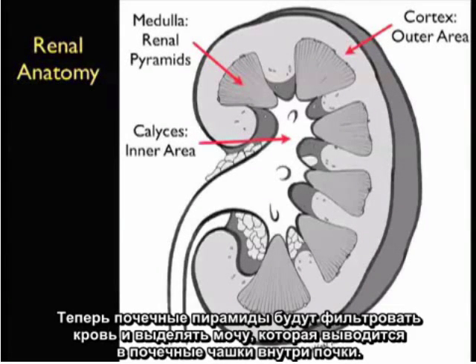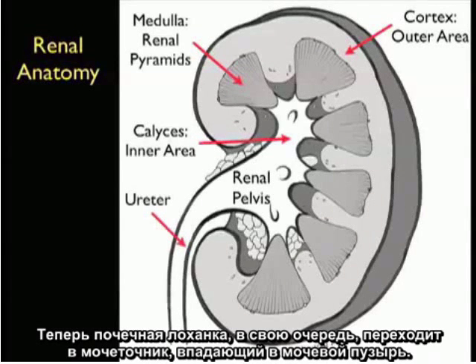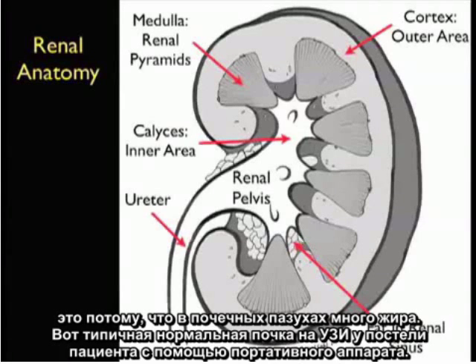Now, the renal pyramids will be filtering the blood and producing urine, which will flow into the calyceal area interior of the kidney. We can see here that the small areas of the calyces come together to make the renal pelvis. Now, the renal pelvis, in turn, will continue on as the ureter inferiorly into the bladder. Now, a classic appearance of the interior of the kidney is that it has a bright or hyperechoic appearance on bedside sonography, and this is because of the abundance of fat within the renal sinuses.